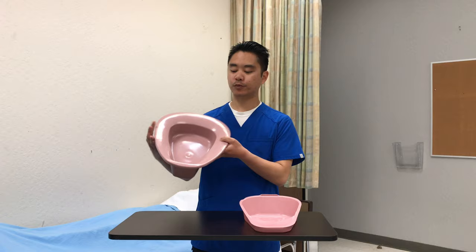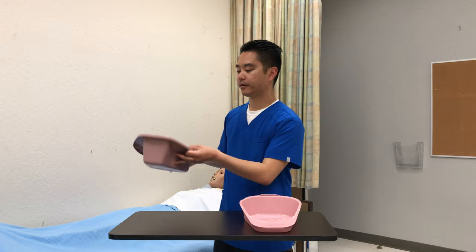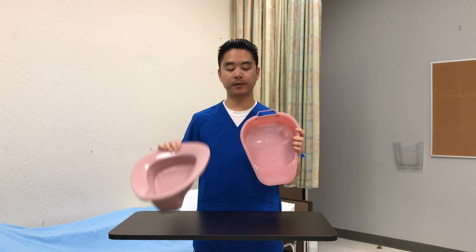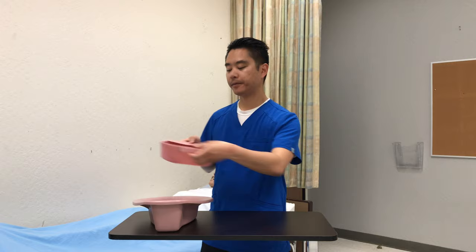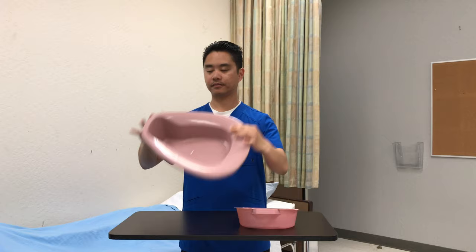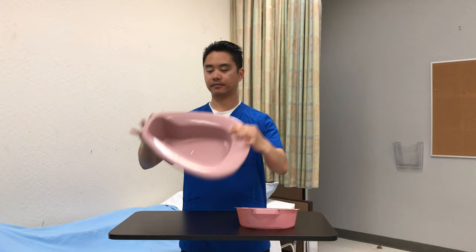Here are the different types of bedpans. The first is a regular bedpan — the patient sits on this part and you angle it with the handle facing this way. The other type is a fracture pan, which is for those who have a hard time sitting on a regular bedpan, such as after surgery. You angle it with the handle here. A tip: look at the angles — the taller part is always facing the feet. These are the different types of bedpans.